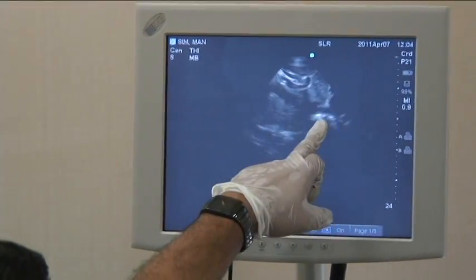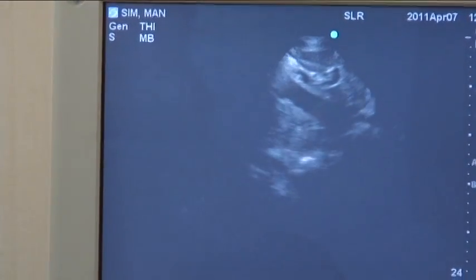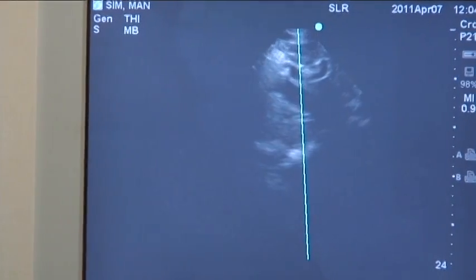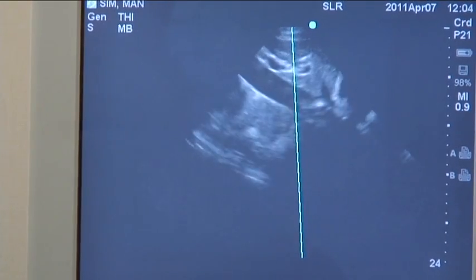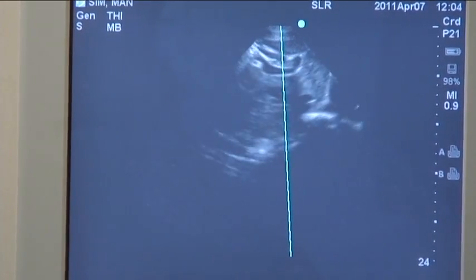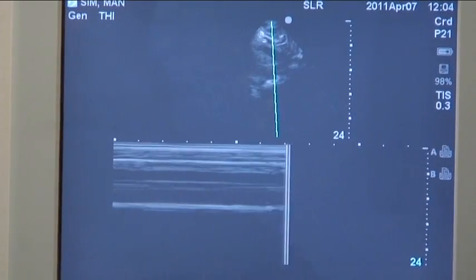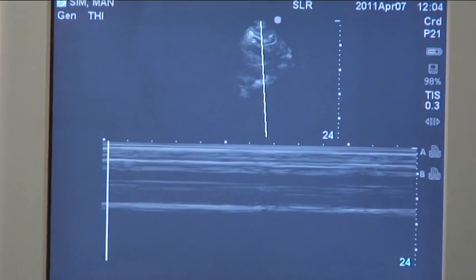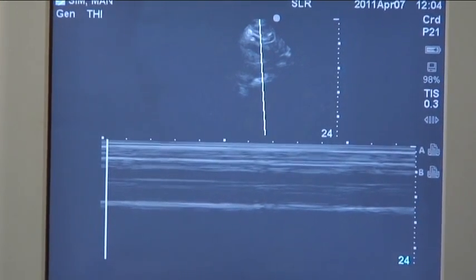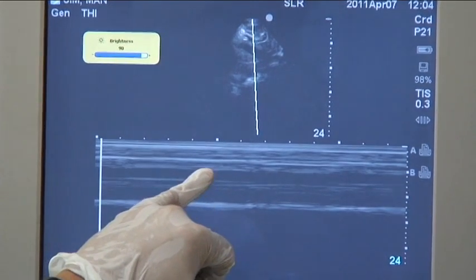You see the right atrium here, you see the IVC here, and now you hit the M mode. Get it about 4 centimeters, as I mentioned there. Get a better view here, nice. Okay, and then we're going to hit the M mode again. And then once you have the IVC there, we hit freeze. We'll just release the pressure on the probe. Just to get this on the view, you notice there's a little bit of variation in the IVC here.